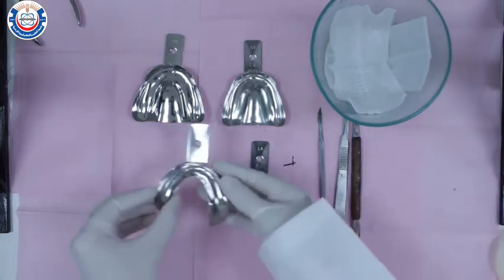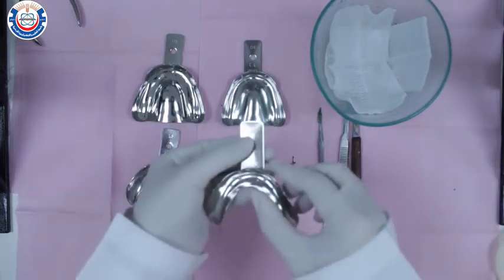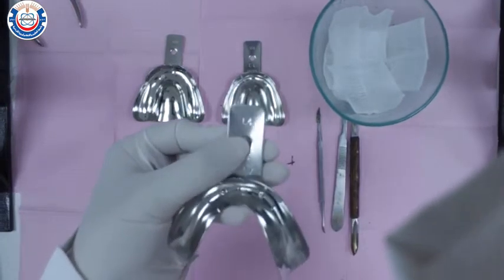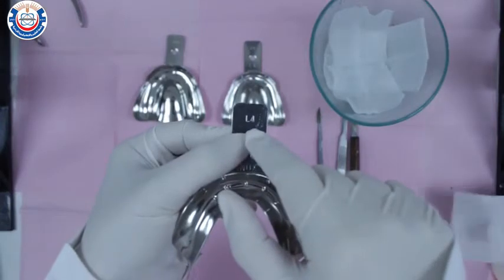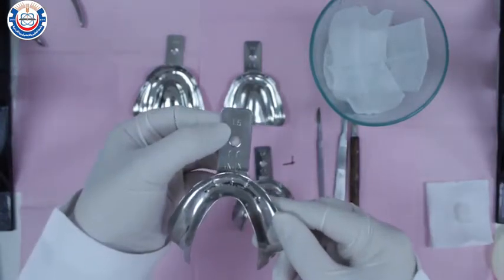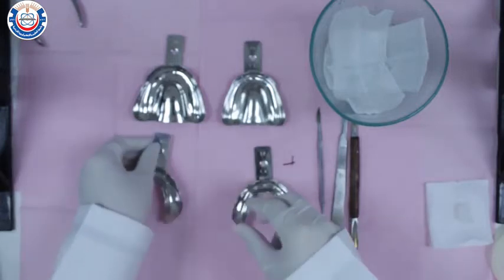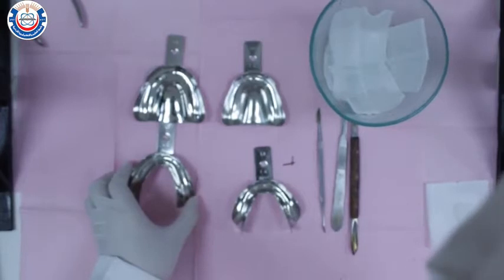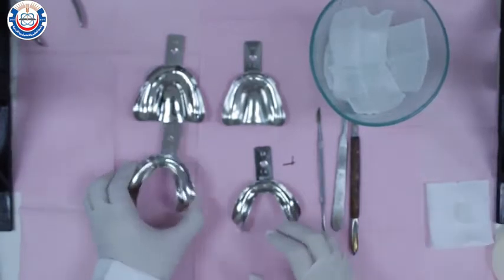Before starting the impression making procedure, you need to select the appropriate tray size that best suits your patient. Here we have size lower L number 4 and L5 — L for lower and 5 for the size of the tray. We're going to take it to the patient's mouth to decide what size is appropriate.